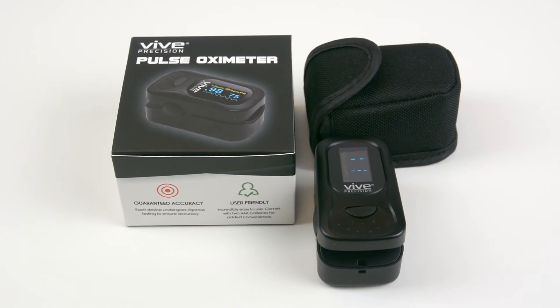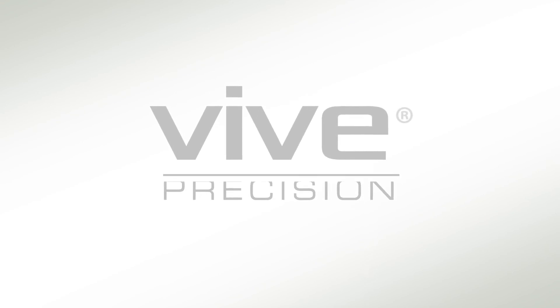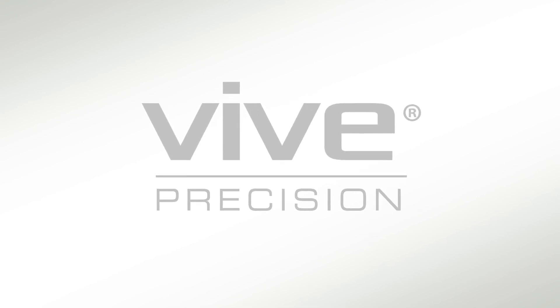Confidently order your Pulse Oximeter now and stay on top of your oxygen levels. Vive Precision — accurate, user-friendly health monitoring devices.